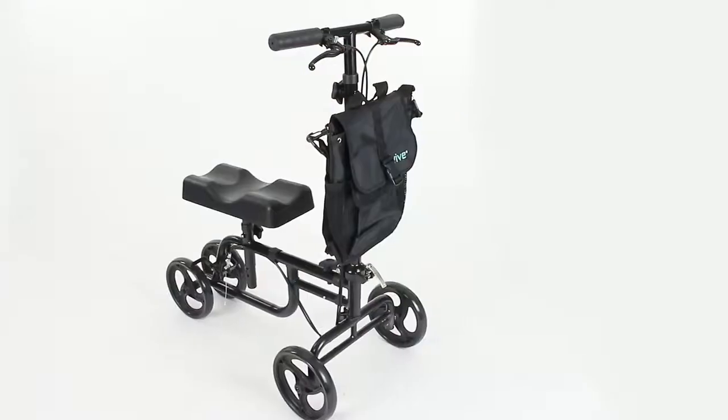Hi, I'm Devin. I'm the head of customer service for Vive Health, and today I'll show you how to assemble and adjust your Vive Knee Walker.